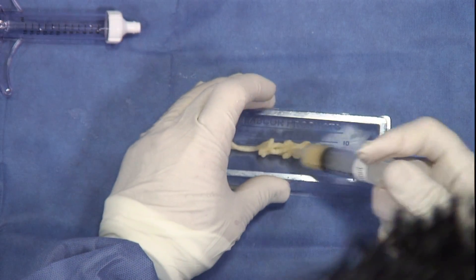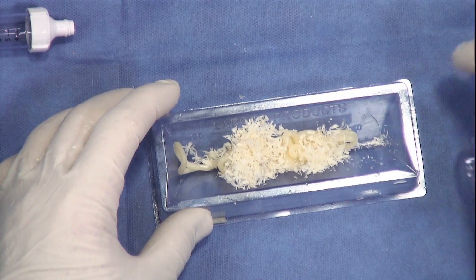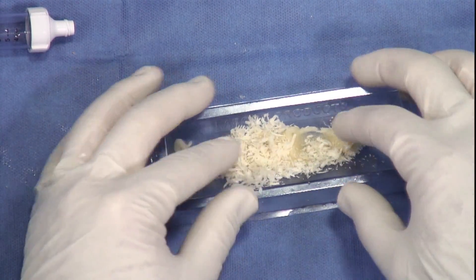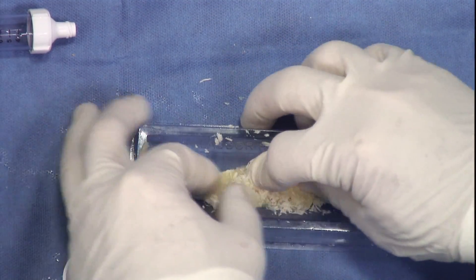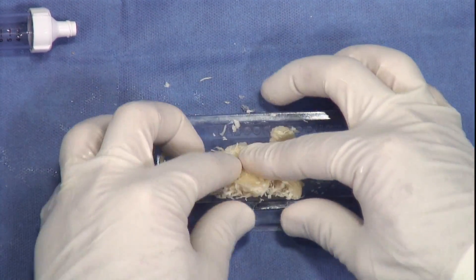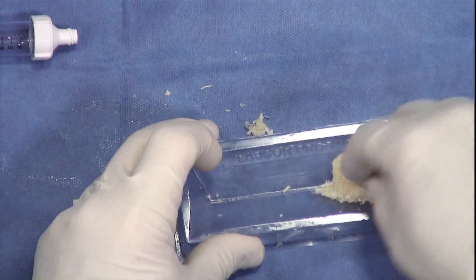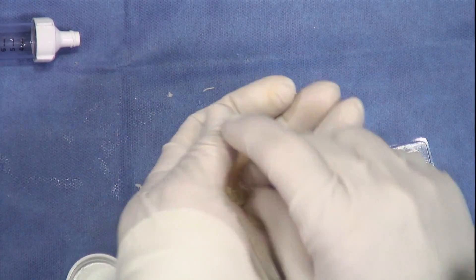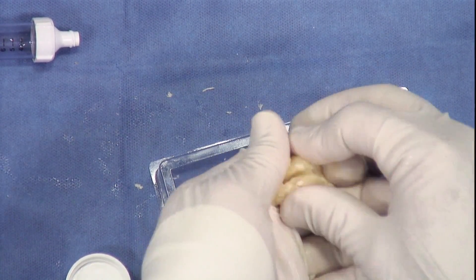To prepare the bone mixture, I place the DBM and mix in the cortical fibers. The cortical fibers have a higher density of BMP than cancellous bone, and the DBM is usually a mixture of bone and a carrier. Adding the cortical fibers increases the percentage of bone in this mixture.